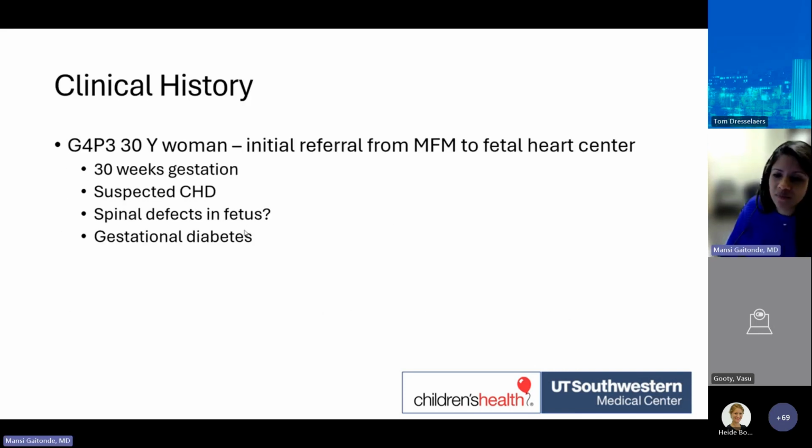This all started with my fetal fellow, who went over to our county hospital with the maternal fetal medicine clinic and was there doing a rotation. She came back in the afternoon and said, I think we found an aortopulmonary window on this fetus, which I thought was really unusual because I've never diagnosed that prenatally. Fortunately, they made an official referral to our fetal heart center. So they always come in through our heart center. And so we start with the fetal echo.